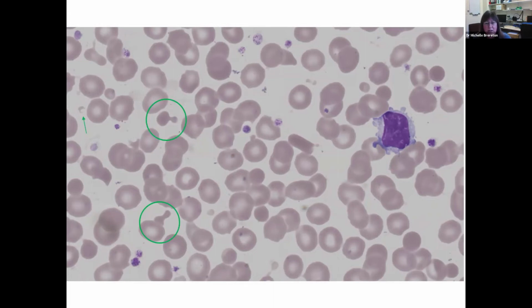So we're actually witnessing here the red cell membrane structural problems, and its attempt to restructure itself, to reclaim the cell and keep its cell contents intact. But if you look around, you'll see that there are some very microcytic fragments. So there's a little green arrow where clearly cell content has been lost.